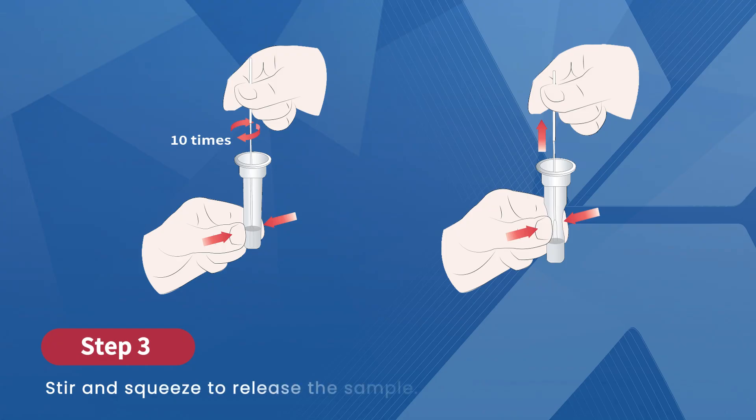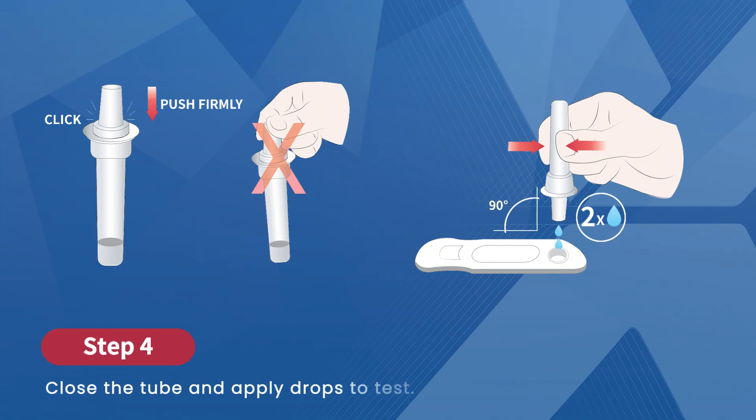Next, it's time to extract the sample. Hold the swab at the bottom of the tube. Squeeze the tube gently and stir the swab 10 times. Pull out the swab while squeezing to get all the liquid, then discard the swab safely. Next, firmly push on the provided dropper tip to close the reagent tube. Be careful — don't touch or grab the hole of the dropper tip.